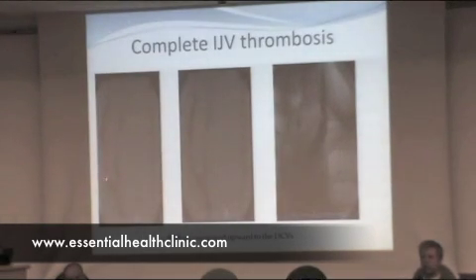In some cases, we can see a complete occlusion of the jugular vein, but this was a secondary occlusion due to central line insertion of the right internal jugular vein. There was no jugular vein on the right side. All the contrast is going through collaterals and filling the left internal jugular vein, which also has tight narrowing, seen here during balloon angioplasty. You see tight narrowing of the left internal jugular vein.